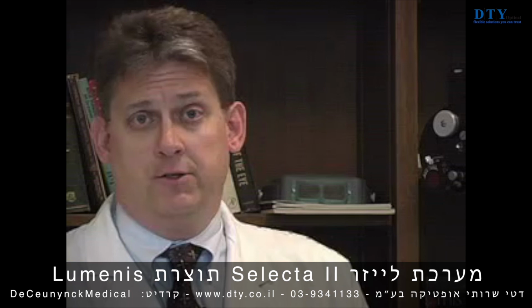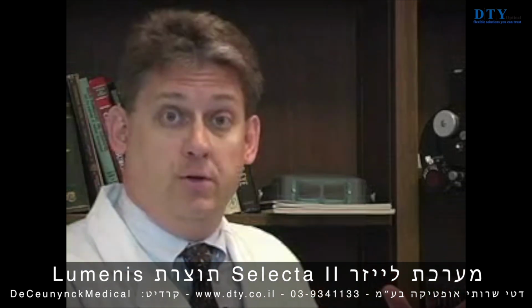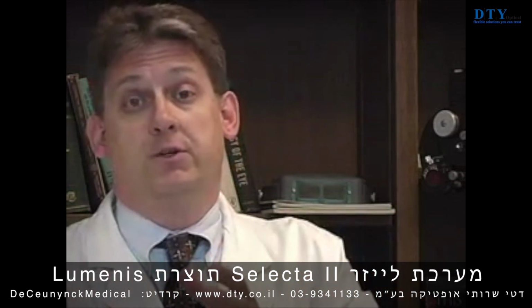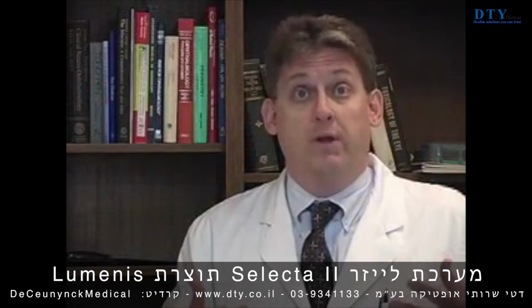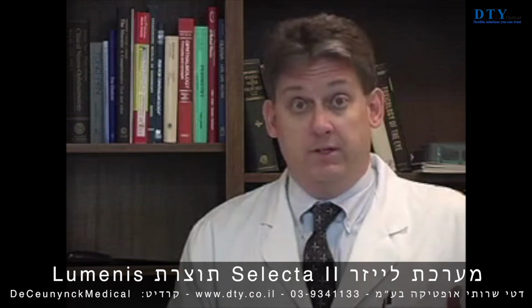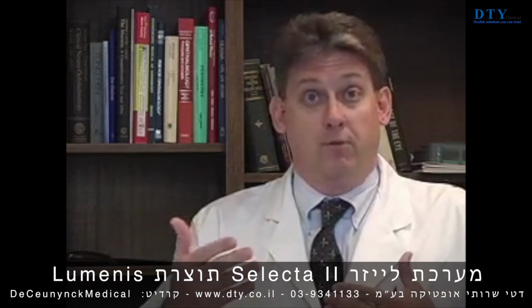The SLT technology can be used in two different formats. Lumenis has produced a portable SLT 2 unit which can hook up to a slit lamp. There also is a duet unit which has both the SLT as well as a Q-switched YAG component which is fully integrated. Patients will ask us what type of procedures are available, what type of alternatives do we have in treating this disease, and SLT is one of the ones that we discuss. And often it at least reduces, if not delays and eliminates, the need for medications for that time period.